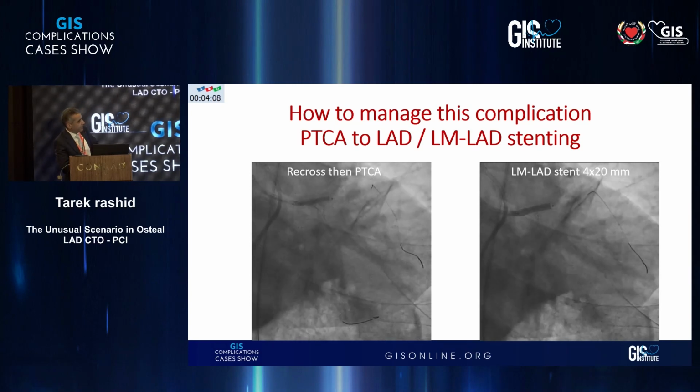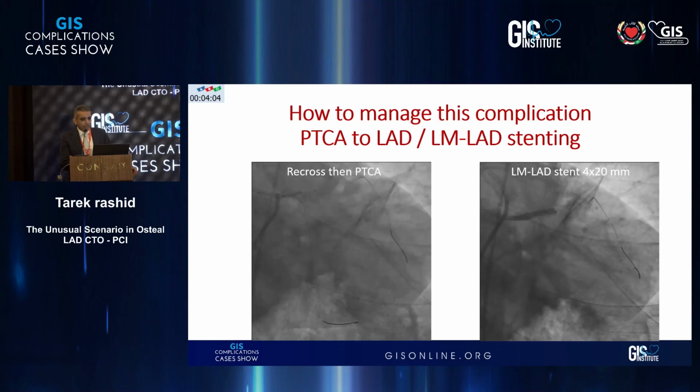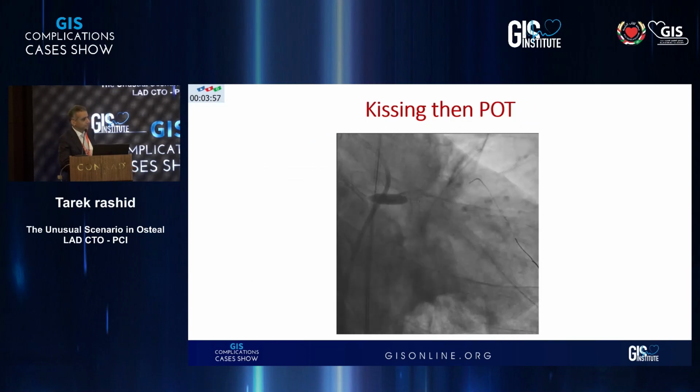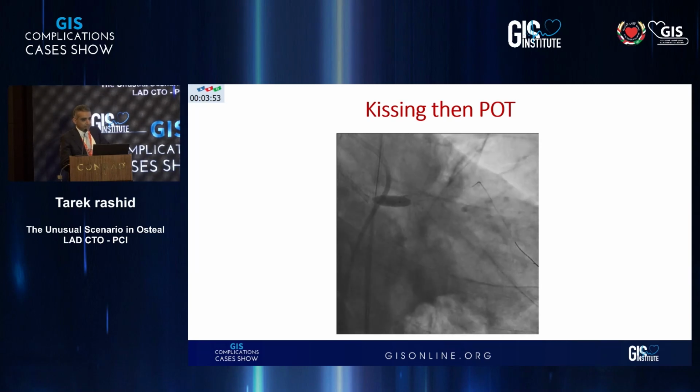And then I recrossed from this stent into the LAD, trying to do an antegrade stenting. And I will tell you why to do this antegrade stenting. Then again, POT.